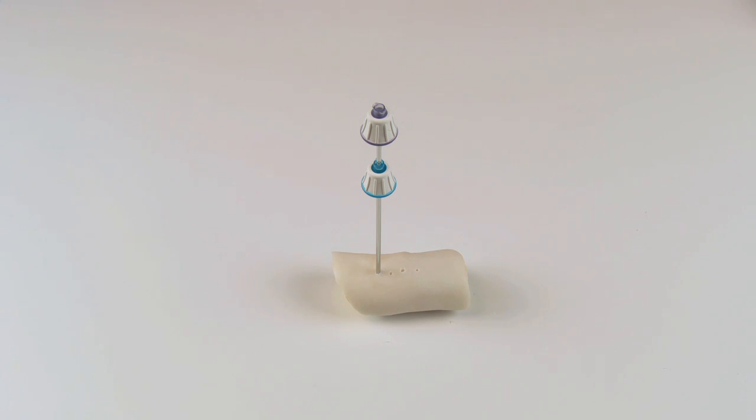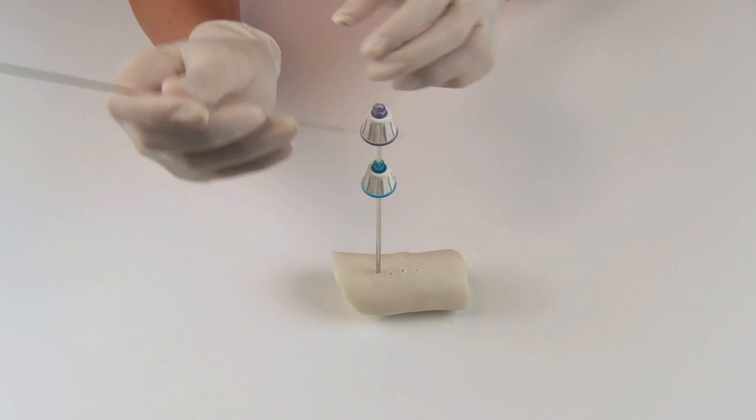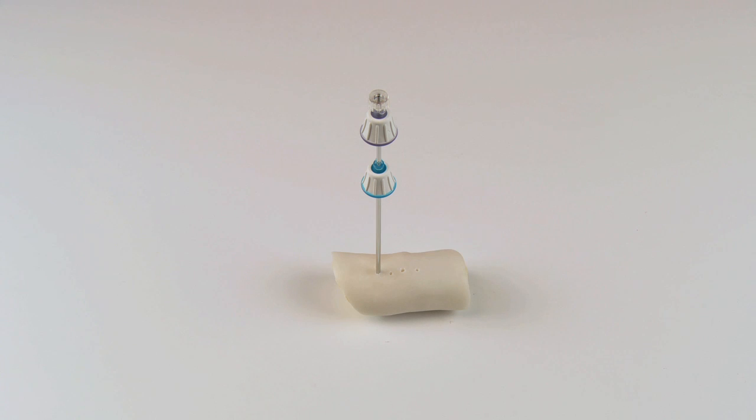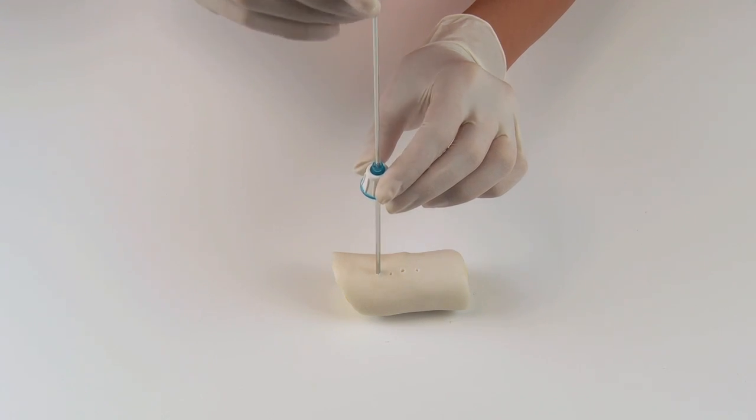Insert the angled pin core lock. The angled pin will trap the specimen in the distal tip of the biopsy cannula. This will keep the sample intact during retrieval. Remove the biopsy cannula and the core lock at once.